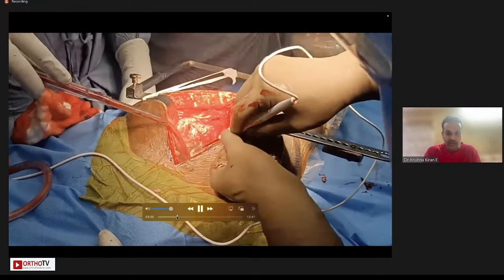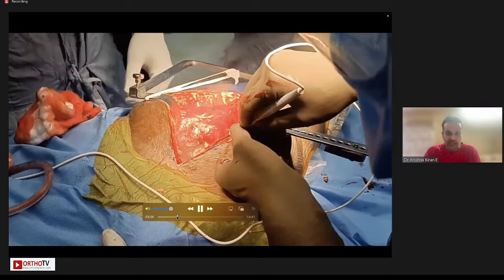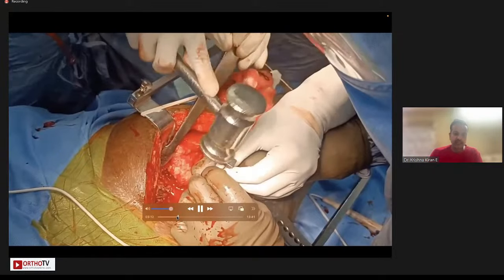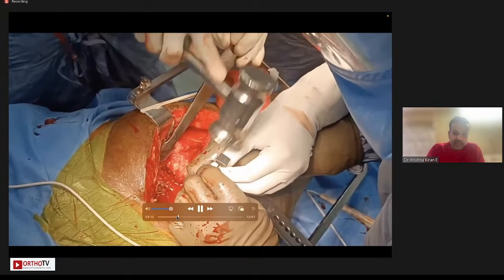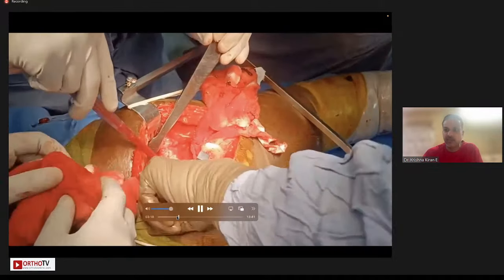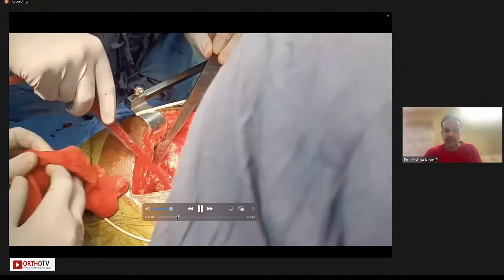So previously I showed you with the chicken scissors, but wherever the scar tissue is more, you can use a diathermy as well. And I'm identifying the ischium and putting a pin into the ischium inside the soft tissue flap. I'm not going beyond the edge of that flap.